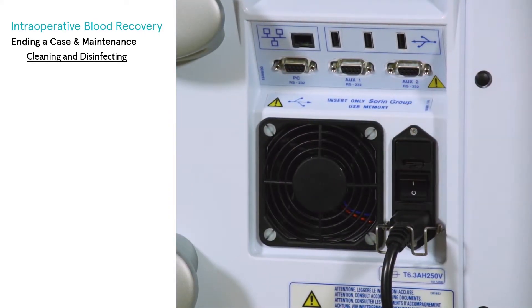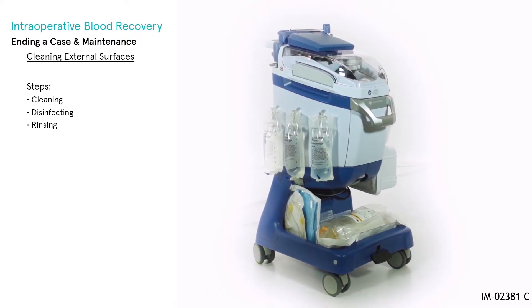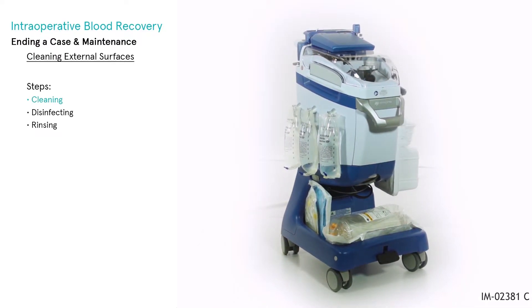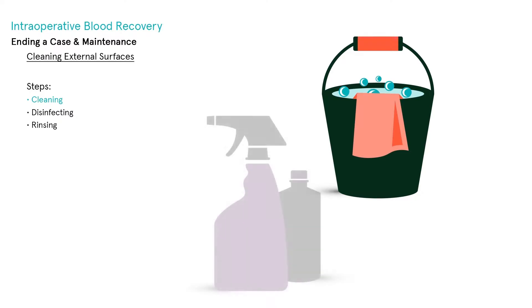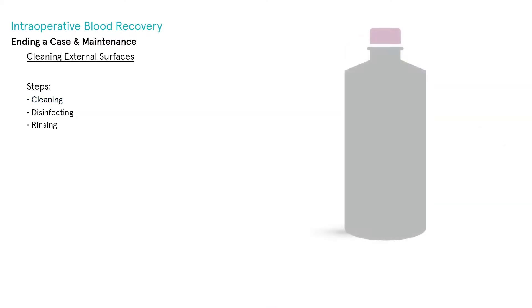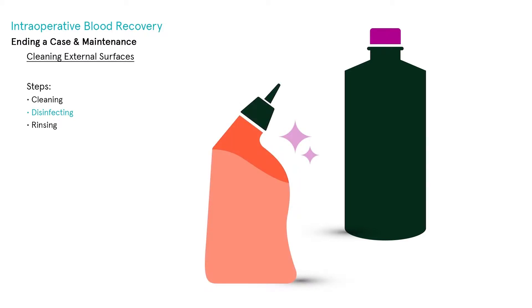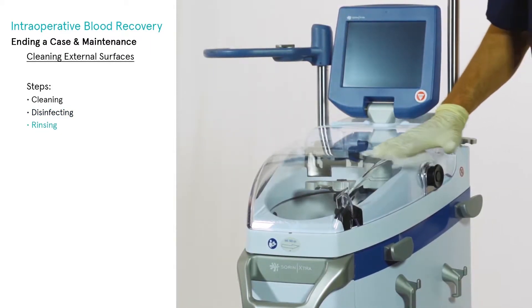Cleaning external surfaces: clean all surfaces of the extra equipment including the trolley surfaces. To clean the external surfaces, use soapy water, ethyl alcohol, and ammonia-based cleaning solutions. Use disinfectant products specifically provided for rubber and plastic medical tools and devices.